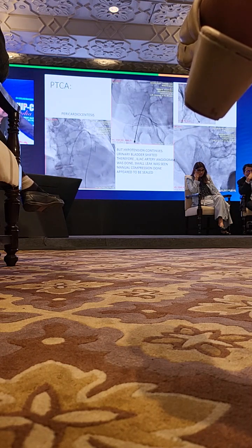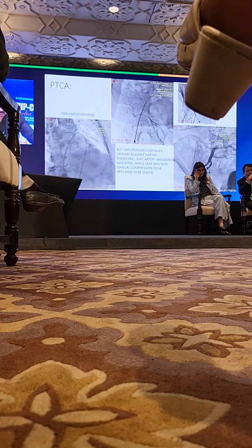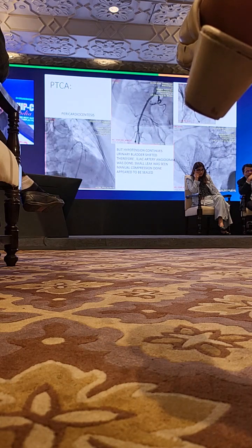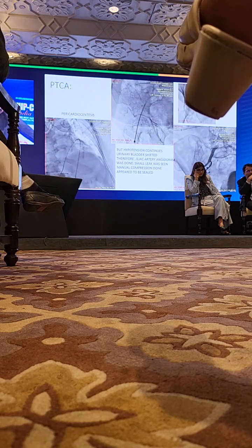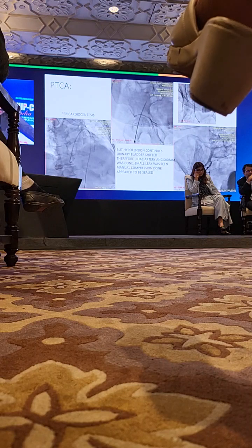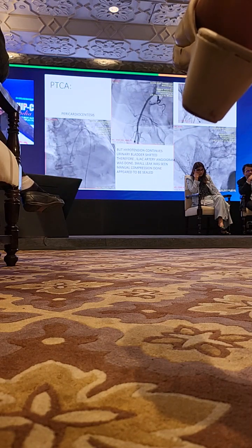In the last extreme right angio you can see the perforation in the initial part, there is a small leak which we are seeing, which has sealed in the last angiogram. I think you can appreciate in the second image there is some amount of leakage which is seen, and in the last it has sealed.